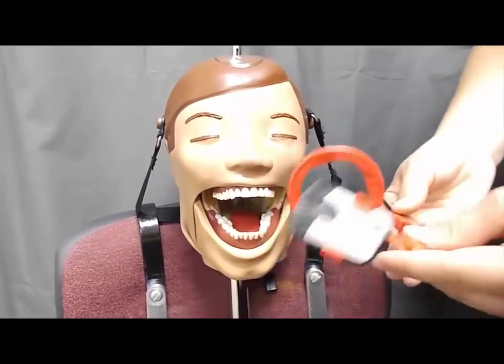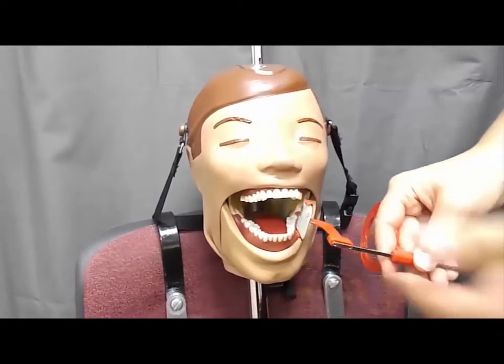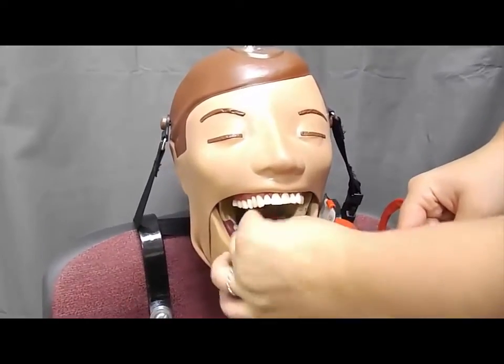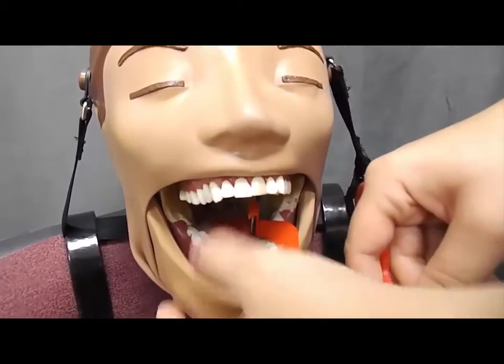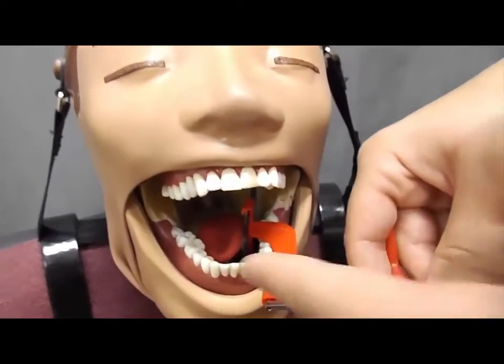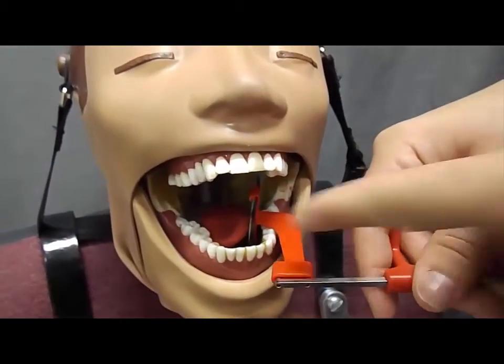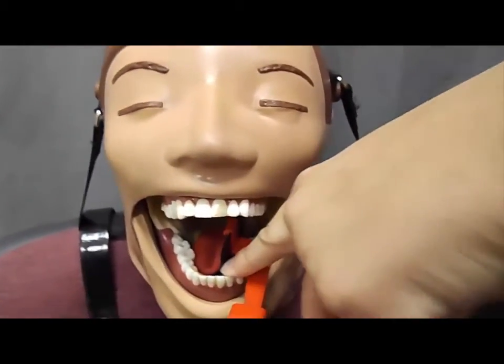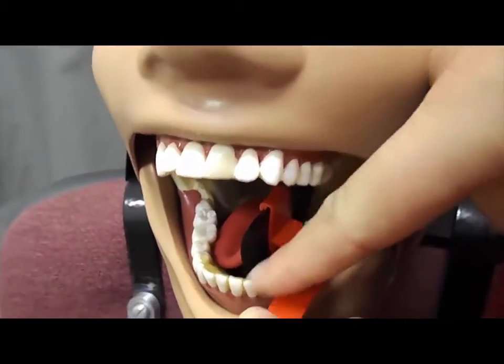When placing your bite wing instrument, you're always going to start with your premolar bite wing first on your patient, and you're going to make sure that you're placing this between the tongue and the dentition. Again, make sure you move Dexter's tongue out of the way. Make sure that you're pushing your bite block midline, or to the middle of the patient's mouth, and that your black phosphor plate is parallel to your premolars.